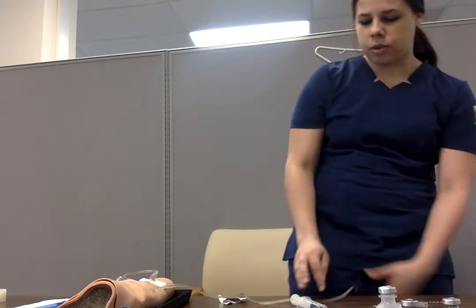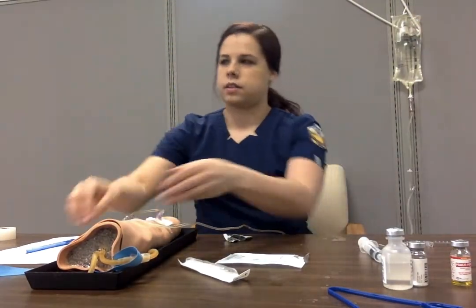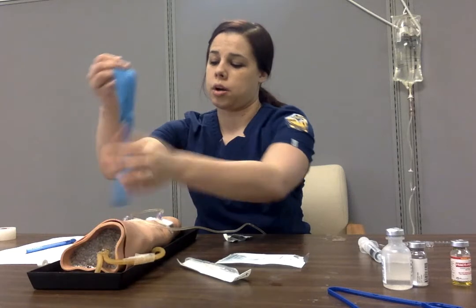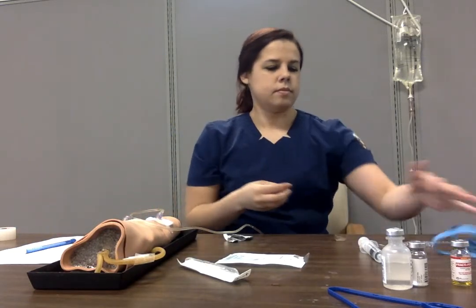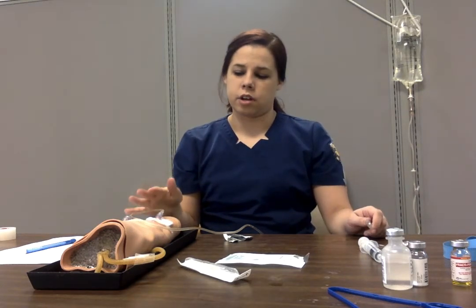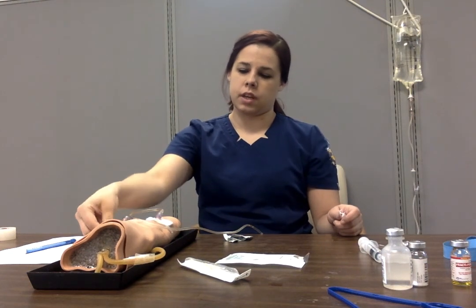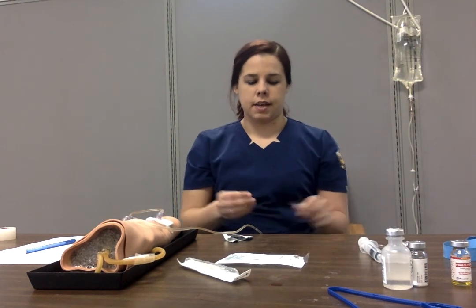And then I would go document everything I did, how we tolerated it, clean up my area, and get rid of my garbage. And I document and I'd assess to make sure his IV was infusing. And I document that he tolerated it well and that the IV is infusing at the rate we needed. And that's it.